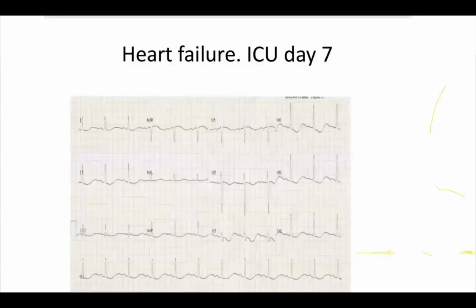So remember, a person in the ICU can always have electrolyte imbalances, okay? And the other thing, they can have ischemia. They can have hypothermia, right? So when it comes to the ECGs, we are worried about 3 electrolytes. Can you name them?